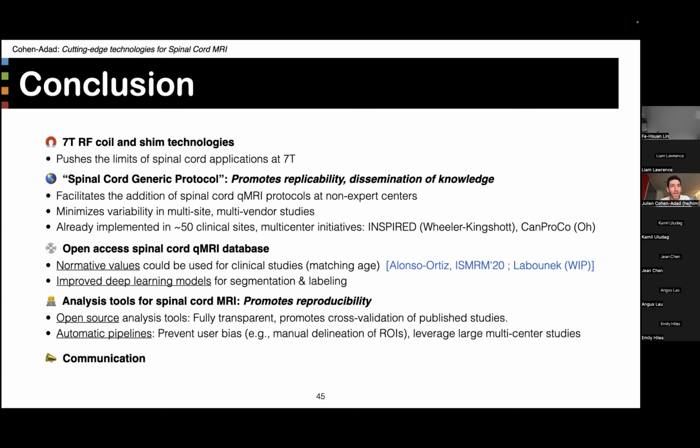And there is also a remaining aspect, which is about communication, and in particular, discussion about unmet needs that needs to happen between physicists, clinicians, and MR vendors in order to make sure that, if there is a good idea that physicists are talking about, it could be implemented by the MR manufacturers and then benefited from by the clinicians.